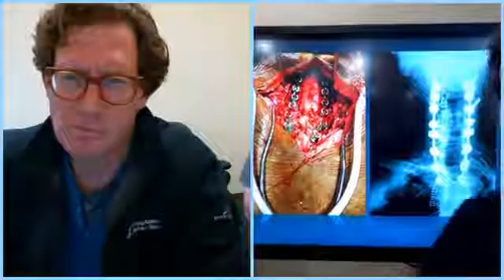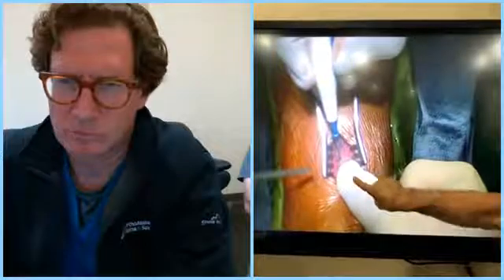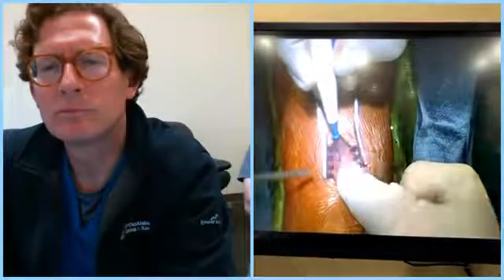They kind of wish that they had never done it because of the comorbidities, the problems that they've had subsequent. So this is a massive incision, massive operation. You can't take it back. Using the ultrasonic technique, we can fix the same problem through an incision, and that's my finger. So the incision size is about that big versus 10 inches.